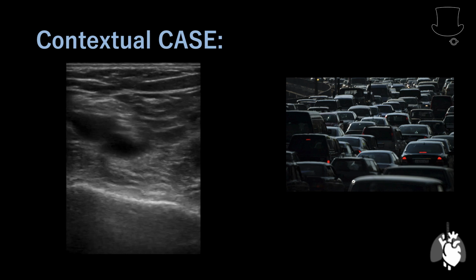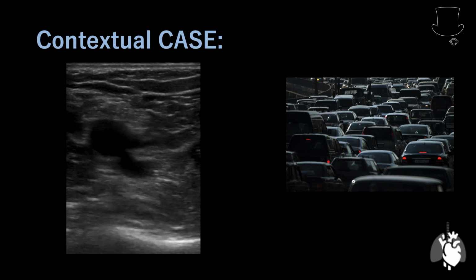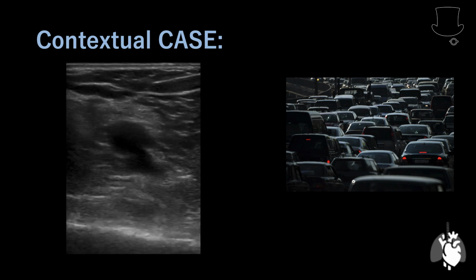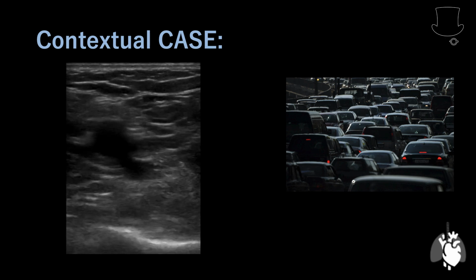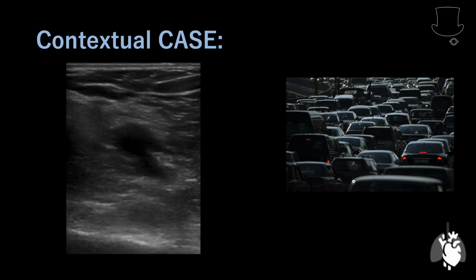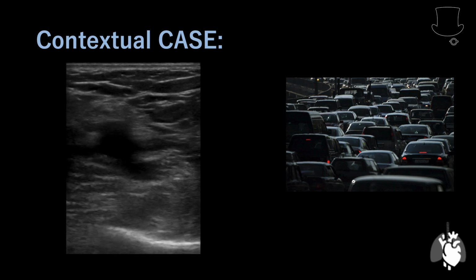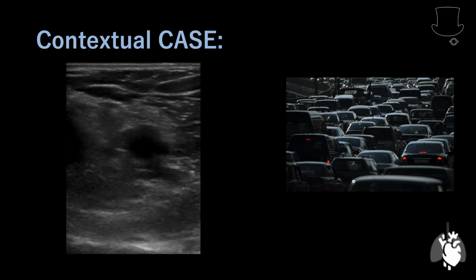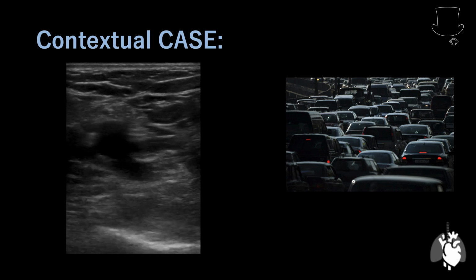So here's our patient. He had a very high Wells score, and this clip was taken from his left popliteal fossa. You can see that the popliteal vein is not compressible. This is very likely an acute symptomatic DVT, and since he is at an average risk of bleeding, it is reasonable in this context to start anticoagulation while awaiting the comprehensive study.